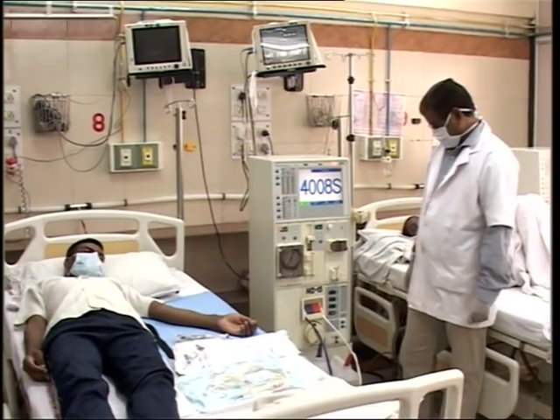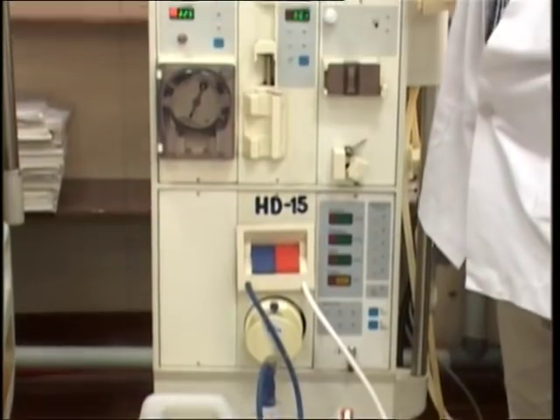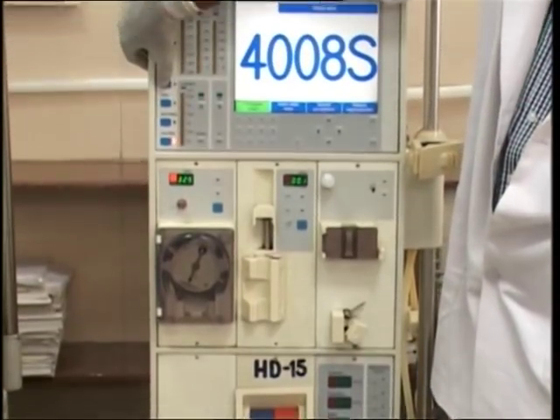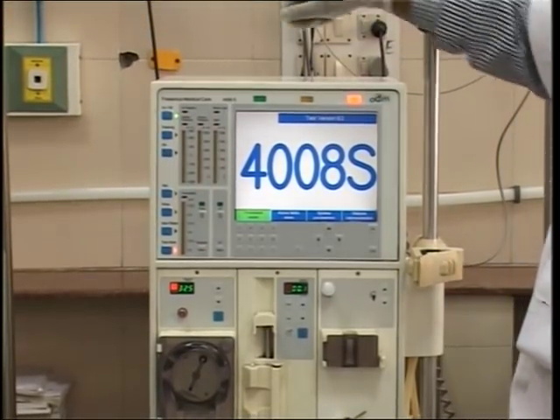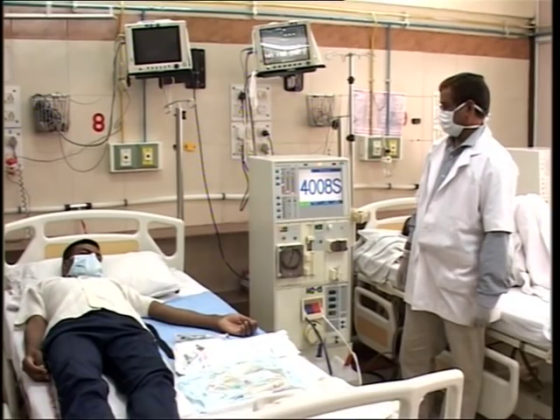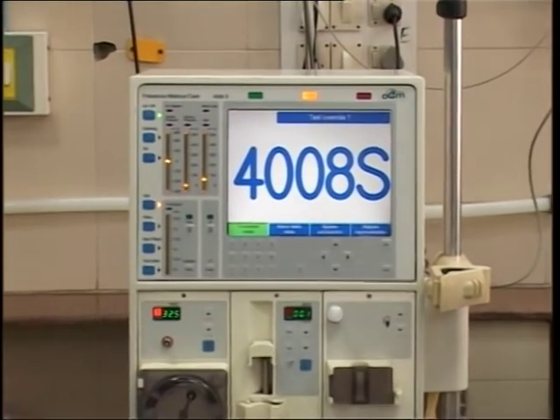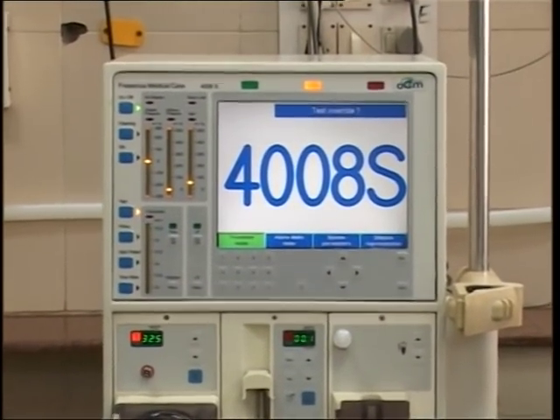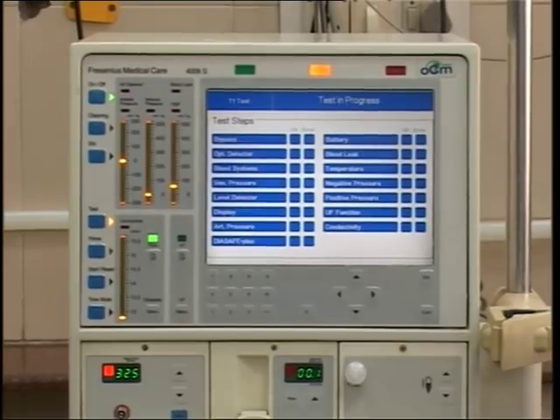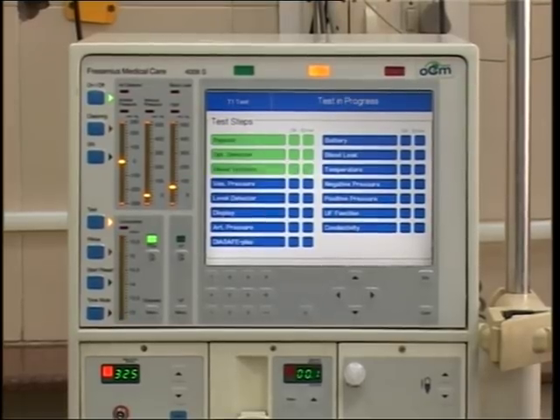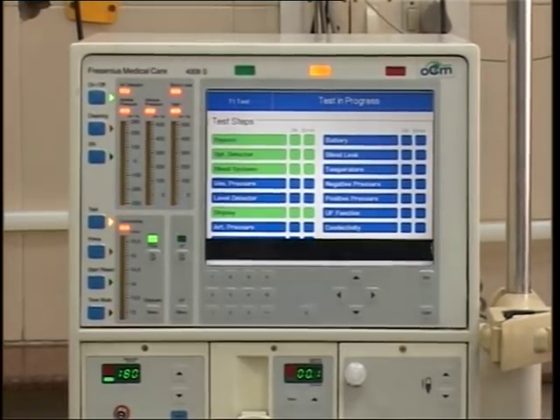Now press the test button on the hemodialysis machine panel. The machine will run a diagnostic self-test, and once the test program is complete, the machine shows that the test is passed on the display panel and also gives an alarm.